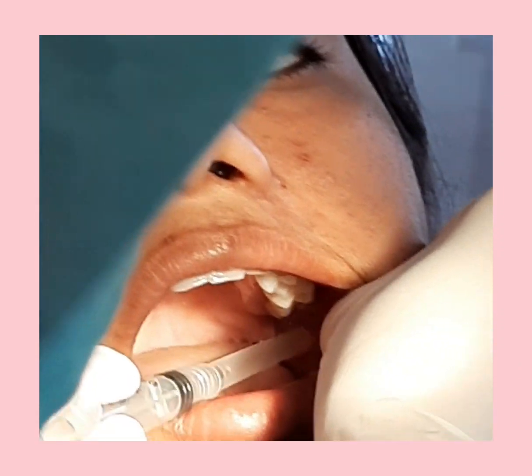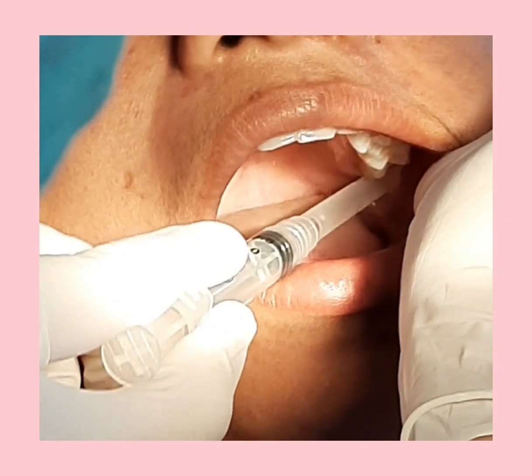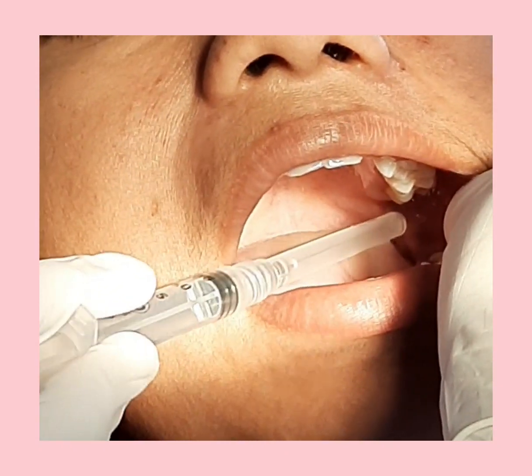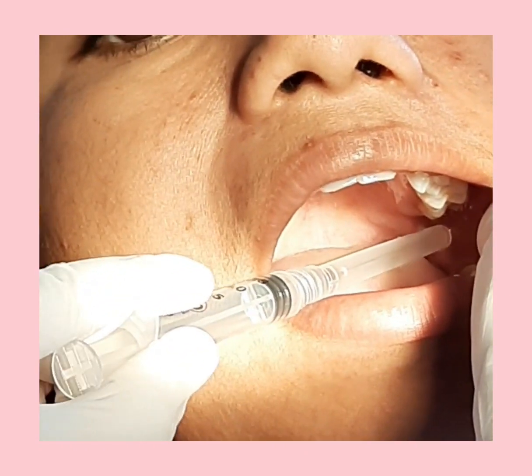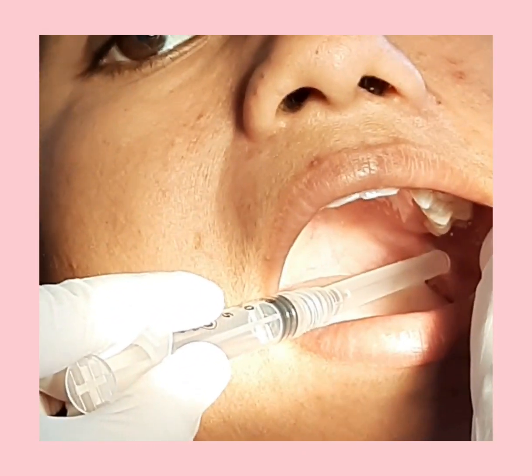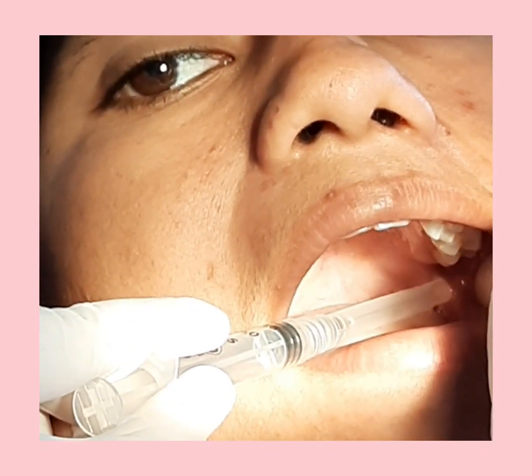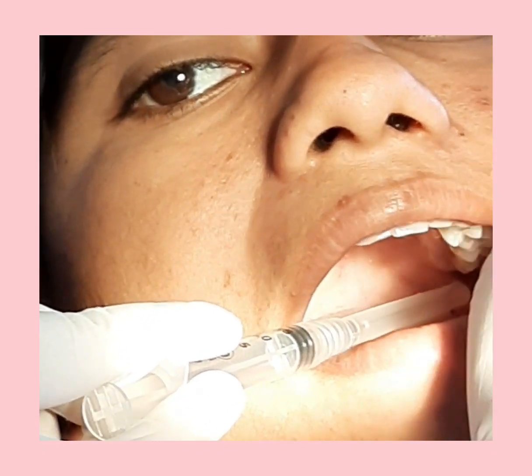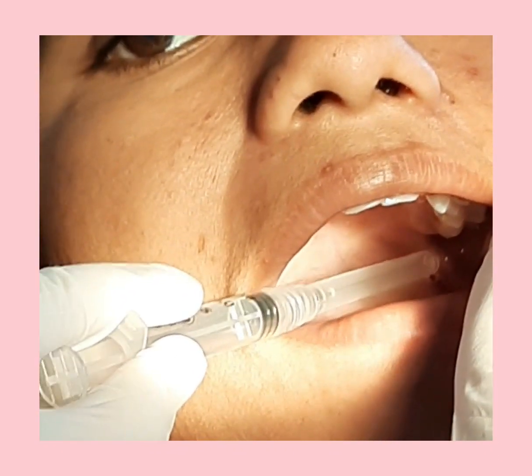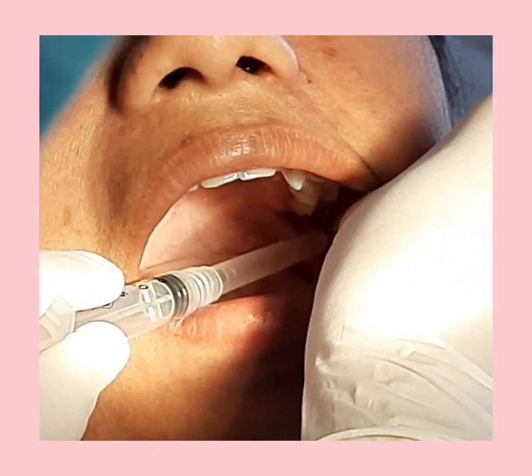You'll also need to visualize an inverted triangle just beside the pterygo-mandibular raphé. Insert your needle in the center of that depression — that's all you need to do.